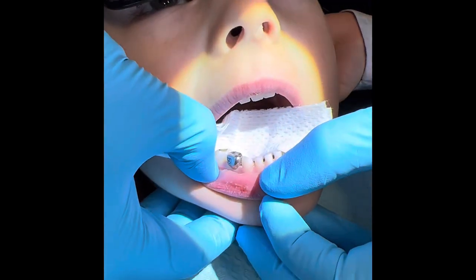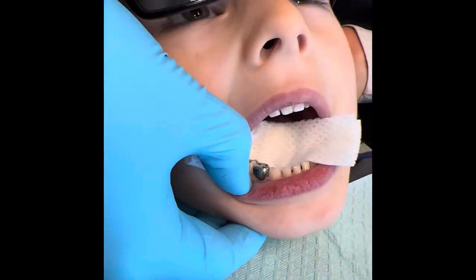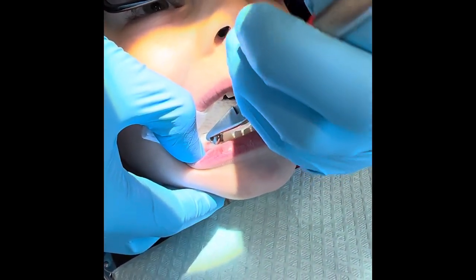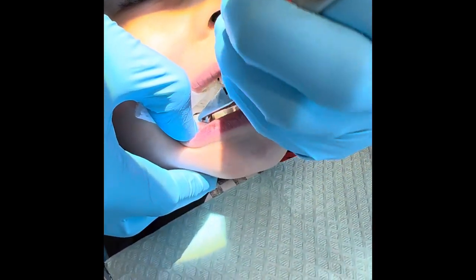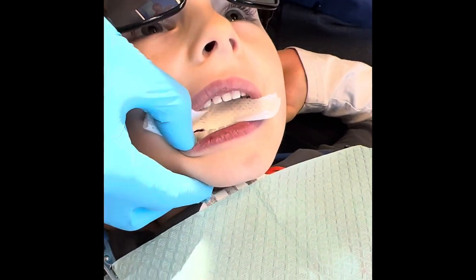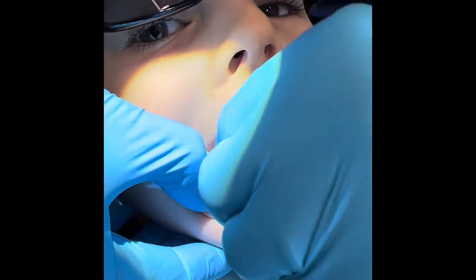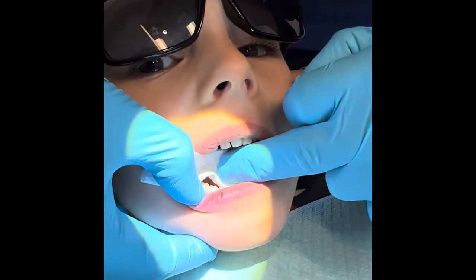You doing okay? Oh good. That's nice — I'm just gonna wiggle, wiggle, wiggle, wiggle. And we'll just try a four on just to make sure, because we want the smallest size possible. I'm pushing hard and the four is not going, so it's a five. Oh cool, all right!